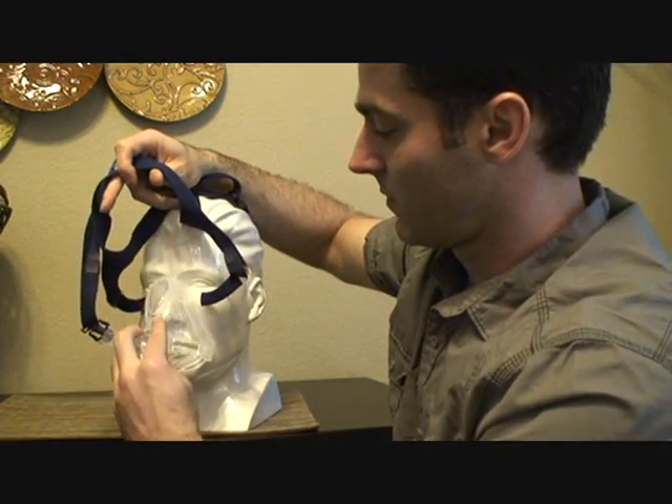So you place it here and bring it over your face. You want it to go from the nasion — the low point in the bridge of your nose — and you want it to cover, leaving about a quarter of an inch to about a half an inch space below your mouth. Then you have a good fit.